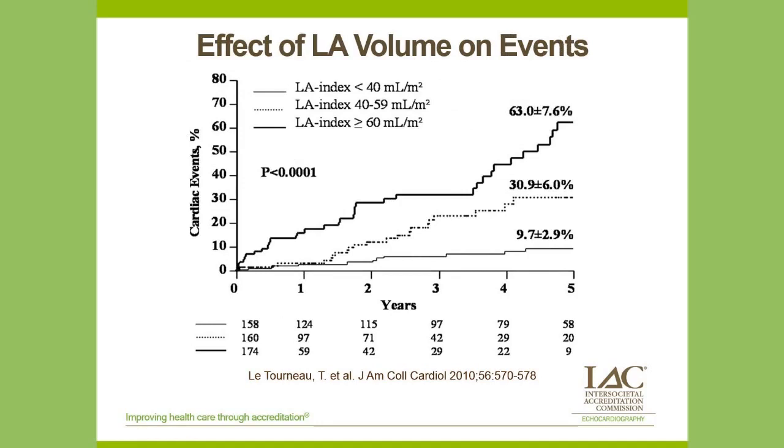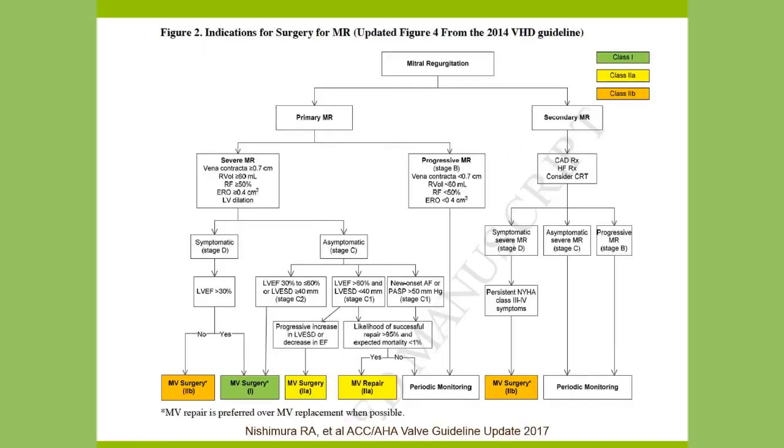This is the same data. It just shows cardiac events, not just death, but other cardiac events like hospitalization and atrial fibrillation. So LA volumes are important to measure and report.